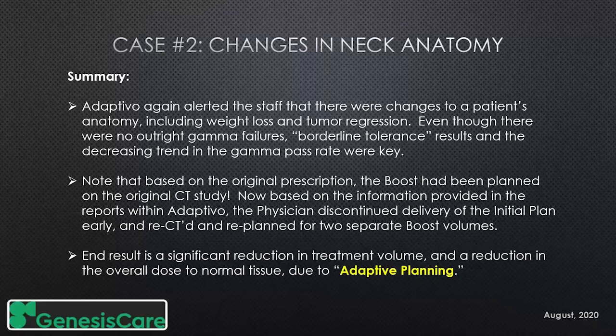The end result is a significant reduction in treatment volume and a reduction in the overall dose to normal tissue due to what I consider true adaptive planning.